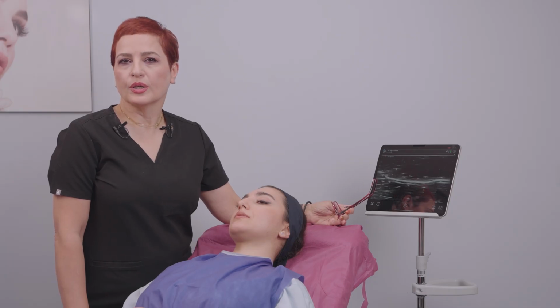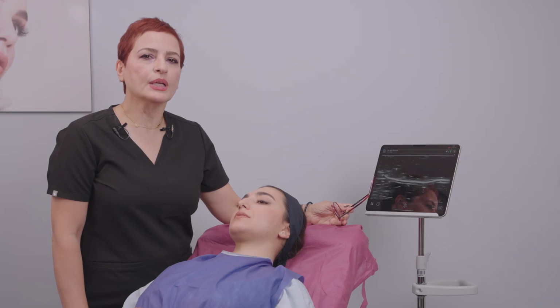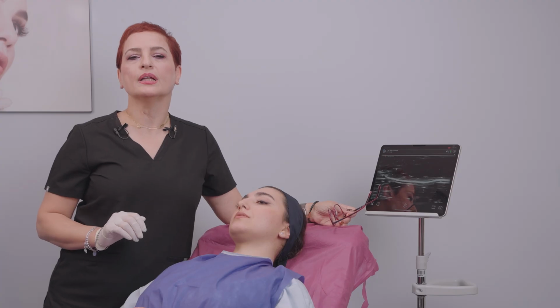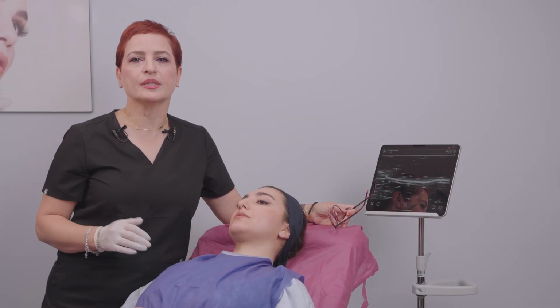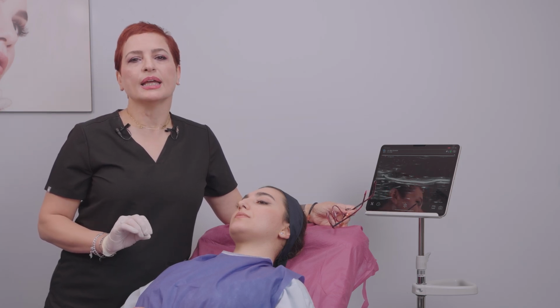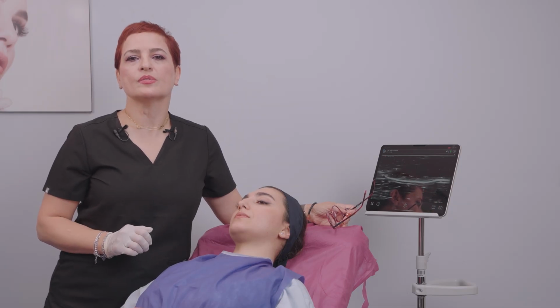Before we start this scan, I'm just giving a brief review of the anatomy of the skin and subcutaneous area. As we know, the outermost layer is the epidermis, then below that we have the upper dermis, then the lower dermis or reticular dermis, and then below the skin is subcutaneous fat.